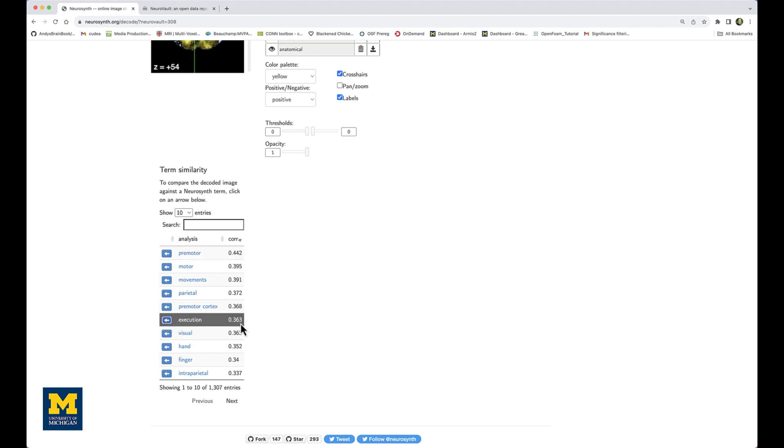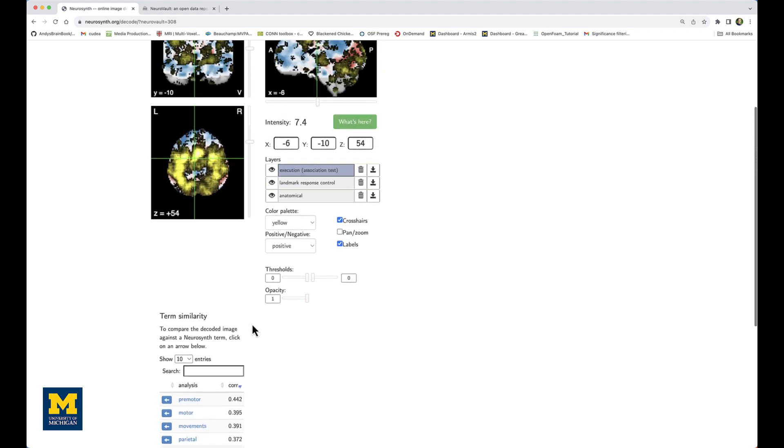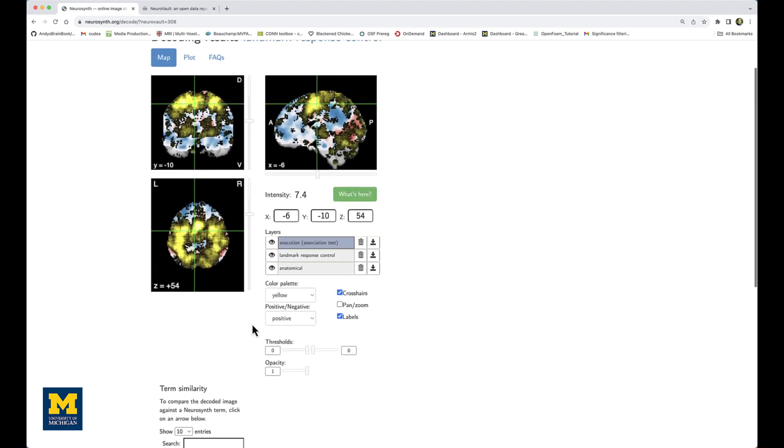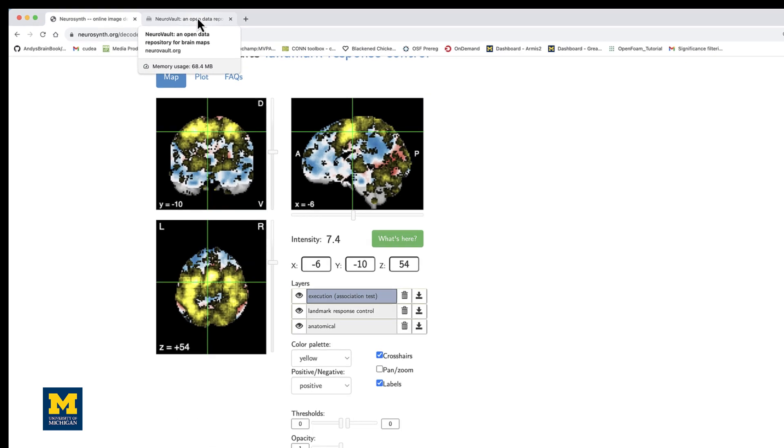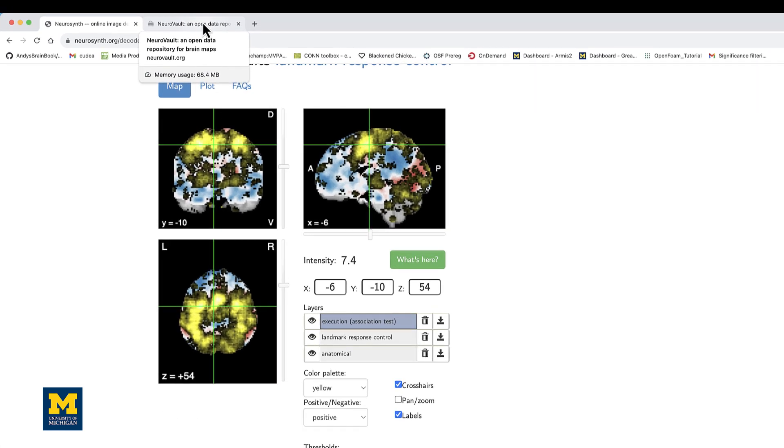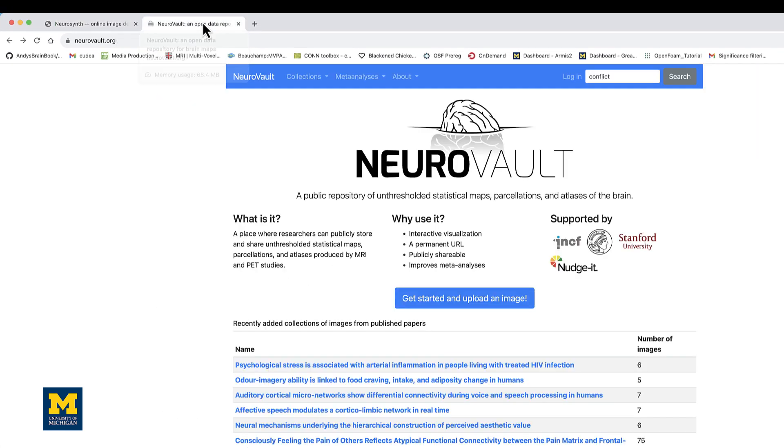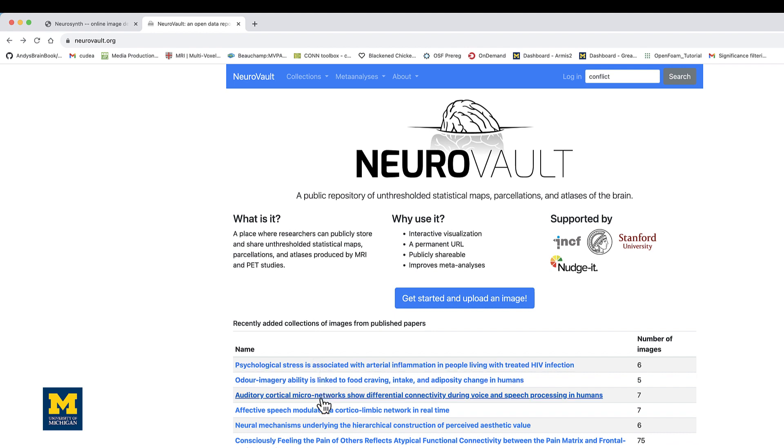And we can do the same process with the execution meta-analysis map. Instead of using the meta-analysis maps in Neurosynth, we can use collections from an associated website called neurovault.org. Instead of meta-analyses, these are collections of group analysis or single subject analysis maps uploaded by individual researchers.